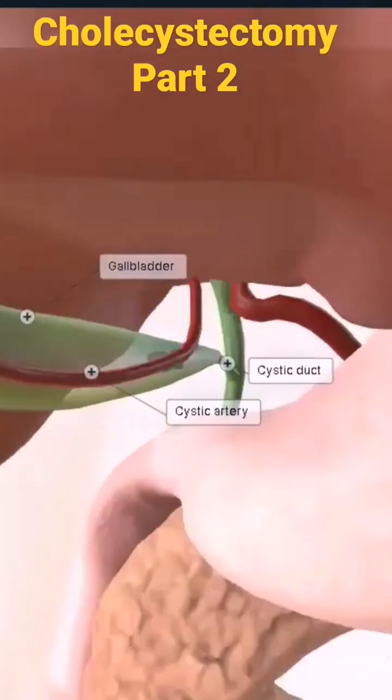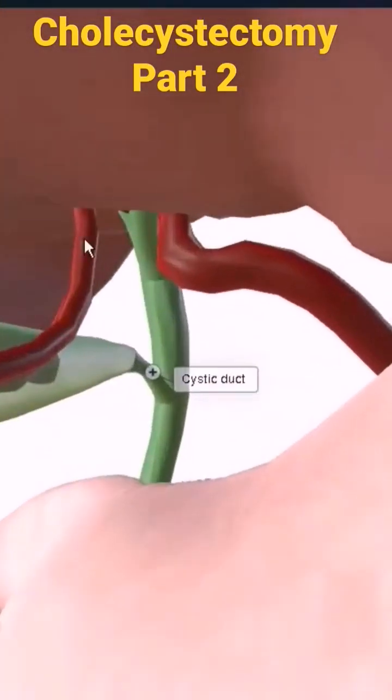Let's zoom in a bit here. Here you can see the Calot's triangle I was mentioning. Here is the common bile duct, here is the cystic duct and gallbladder, and the liver — this is your triangle. And here is the cystic artery.